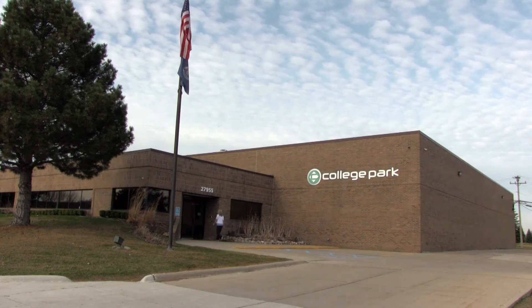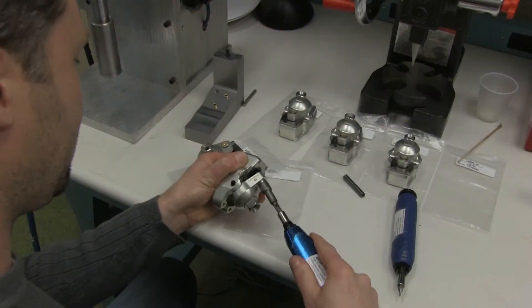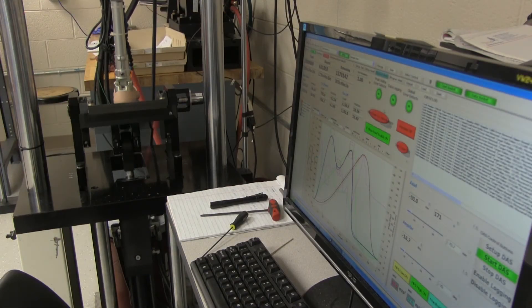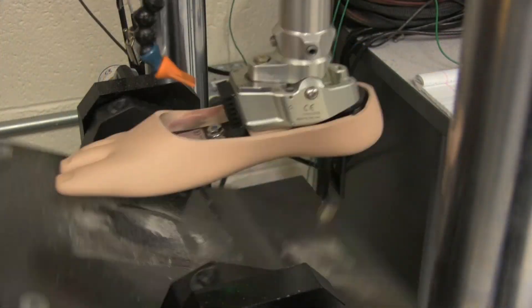All College Park feet are designed, hand-built, and shipped from our Michigan headquarters. College Park is ISO 13485 certified with an extensive focus on quality testing and precision manufacturing.